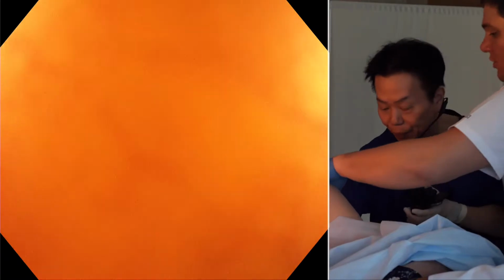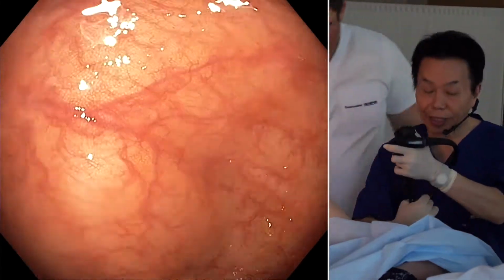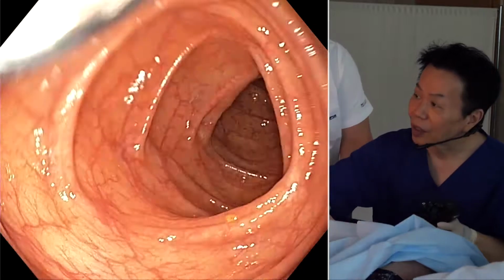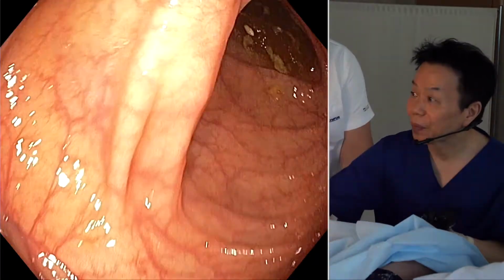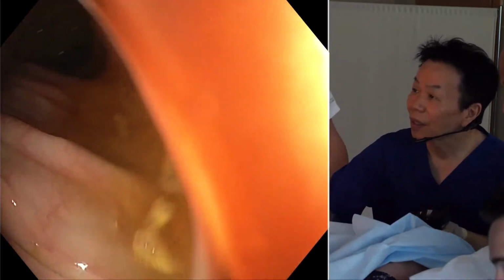Yes, that's better. That's better. And you should return the rigidity to the normal. So stiffness to the normal. Now, I think we are near the hepatic flexure. And pull back a little bit to see the ascending colon.